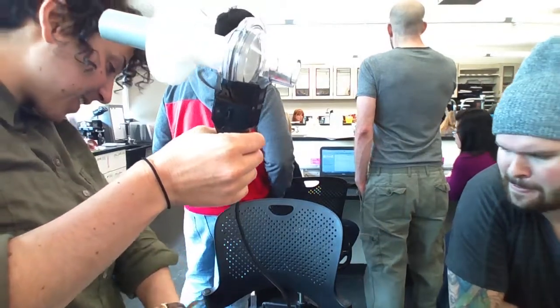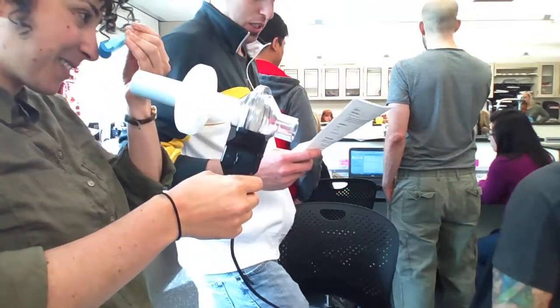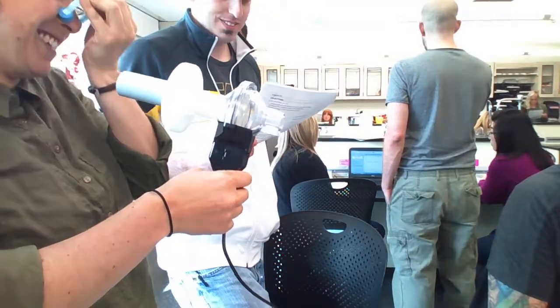Prior to data collection, practice taking several breaths for 20 to 30 seconds, getting used to breathing through the equipment. Be sure to have a tight seal between your lips and the mouthpiece.